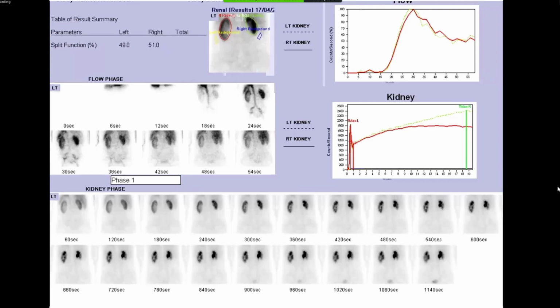If my interest is only to look at the renal function and also to look at any cortical scarring, then I'm not really interested in excretory function. Then I would do a DMSA. You use DMSA mostly in patients with pyelonephritis, where we want to look for renal scarring. But whenever you have a patient with a renal stone, a ureteric stricture, or a congenital PUJ obstruction, you are interested in excretion, so you use either DTPA or MAG3.